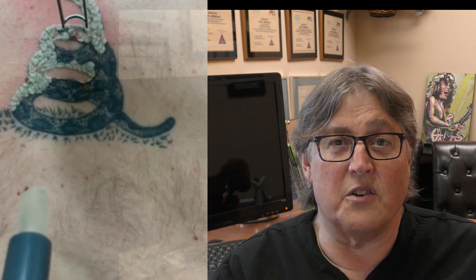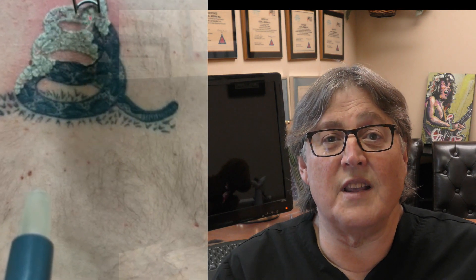Cavitation could fool you. You could start to think that the tattoo was gone, especially in a light-skinned individual. However, in about 20 minutes, the cavitation disappears. Now his tattoo is going to be raised for about a week, and you might see some red little punctate hemorrhaging around the edges of the tattoo starting in the next few hours.